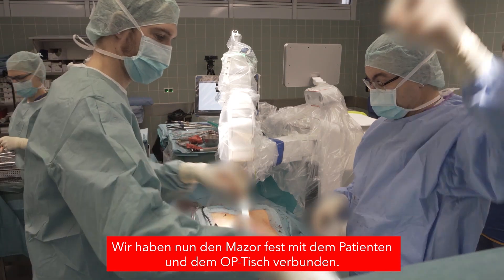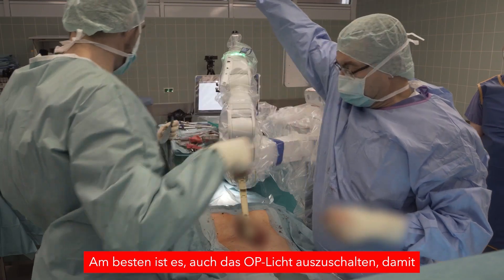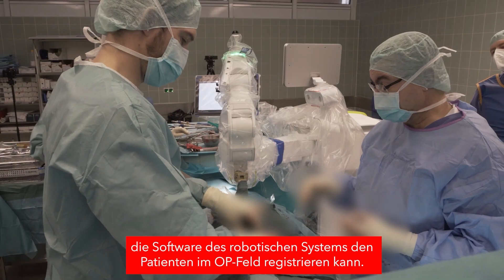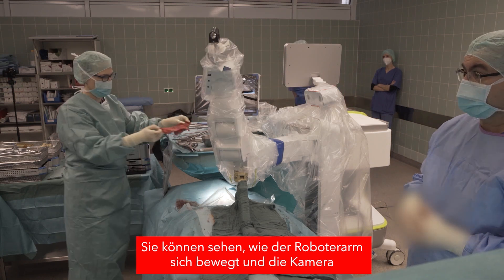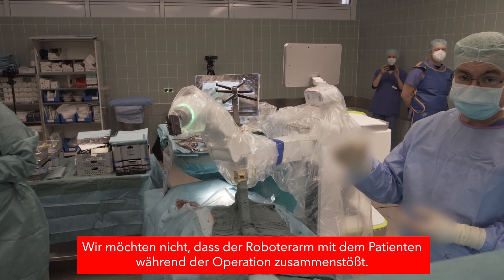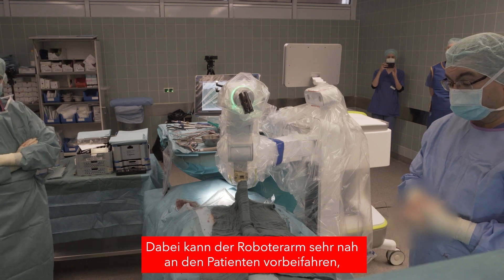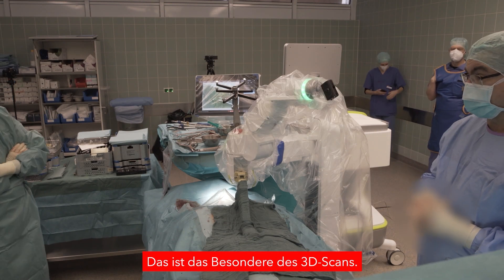Now it's fixed. We're moving away the instruments so that a 3D fine scan can be performed. Ideally we move away the light as well so nothing disturbs the camera. Here are the cameras of the robotic arm, and we are draping the patient surface now. The idea is that the robotic software system knows where the patient is in the operating field. The arm moves and the camera takes photos of the patient's surface. We don't want the arm to collide with the patient intraoperatively, so the system has to know exactly where the patient is in order to move around from one side to the other and avoid collision. The arm can get relatively close over the patient's surface, so it doesn't have to go back and forth repeatedly — that's how we save time. That's what the 3D fine scan is about.